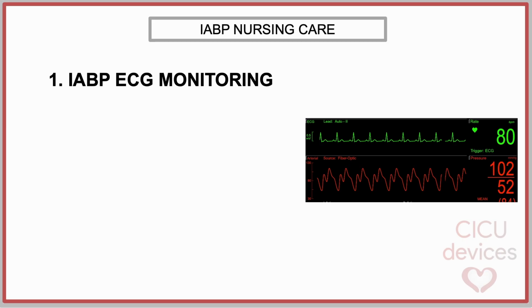Although most contemporary intra-aortic balloon pump models incorporate fiberoptic pressure sensors, these technological advances do not eliminate the fundamental requirement for high-quality electrocardiographic monitoring. Rather, they complement optimal ECG signal acquisition to maximize device performance across a broader range of clinical conditions. Particular attention must therefore be given to the quality and reliability of the electrocardiographic signal, as accurate balloon inflation and deflation are critically dependent on appropriate triggering.